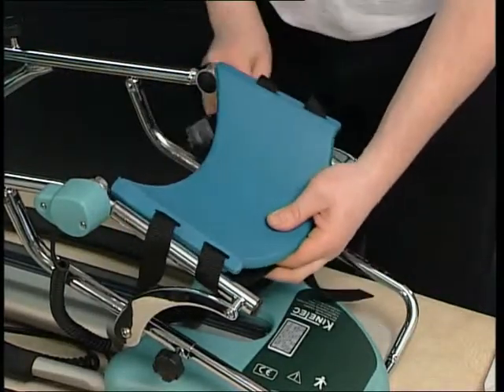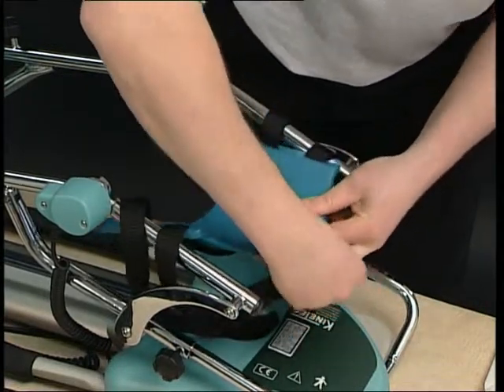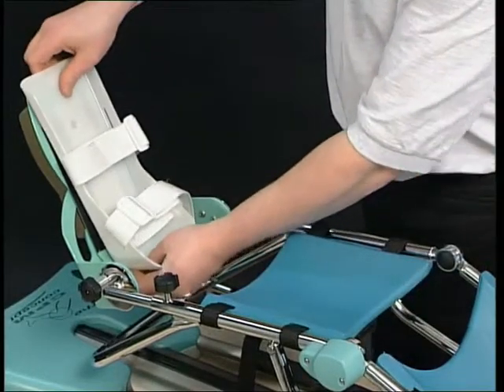We recommend that the support be wiped down before each patient. Put the thigh support in place and then the leg support. Put the foot support in place.